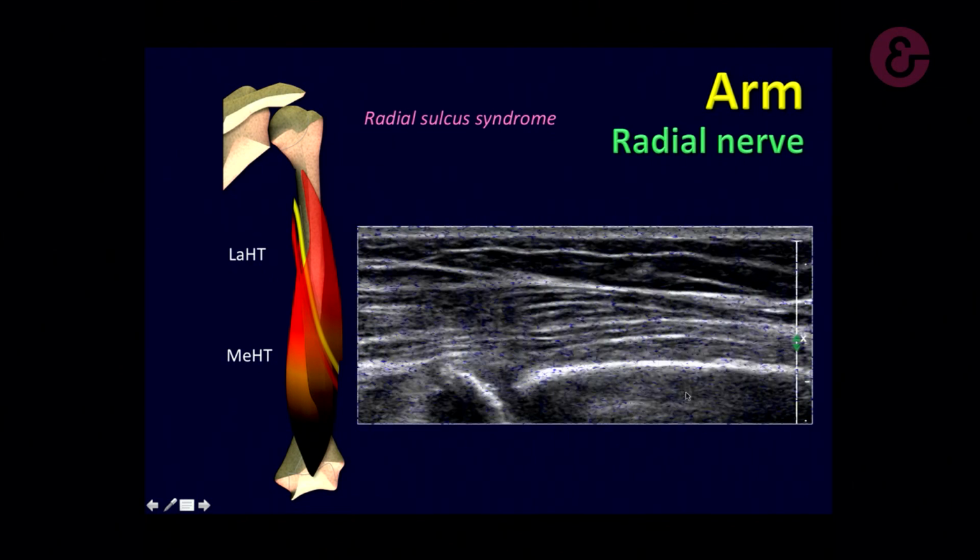If you make a longitudinal, you can see the nerve here running over there, the fracture over there, and the hypoechoic area which surrounds the compressed nerve. There is not a huge change in the nerve, but there was the deficit in the extension. And this is the typical appearance of the callus, which is not yet calcified, compressing the nerve. Very easy to do that by ultrasound. There is no problem at all.